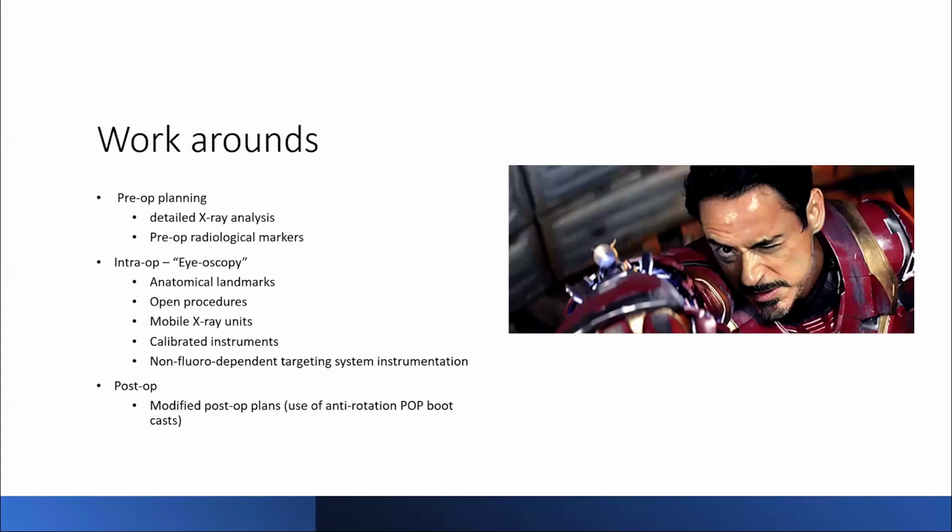And then there are non-fluoro dependent targeting instrument systems. The SIGN nail is one. We have used this. It's a bit like the workhorse for fracture and deformity correction surgery in this setting. And then post-operatively, you modify your post-operative plans, and this would be based on the type of surgery that you have done, essentially.